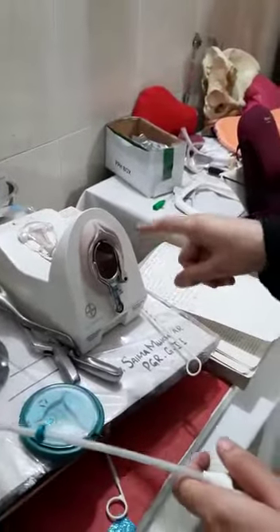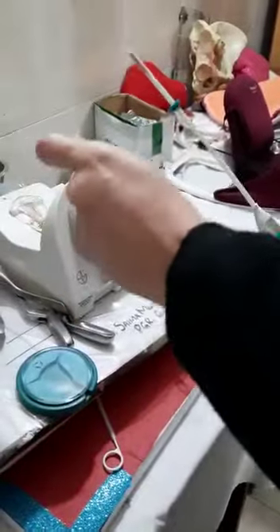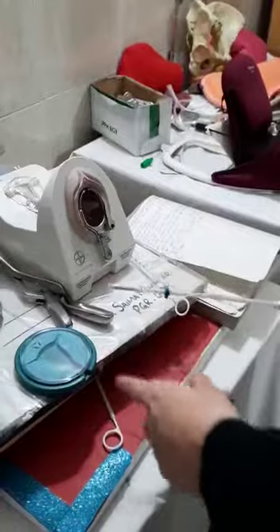I will clean the cervix and the vagina, then I will hold the anterior lip of the cervix with the tenaculum so that I can obliterate the angle between the cervix and the uterus.